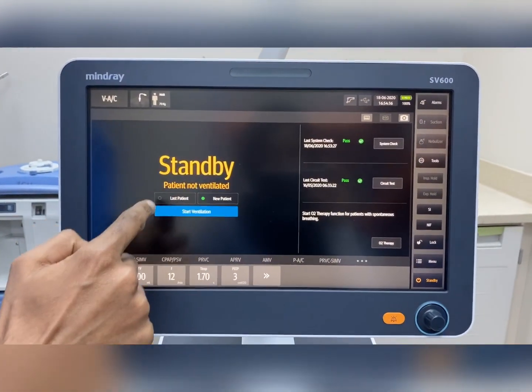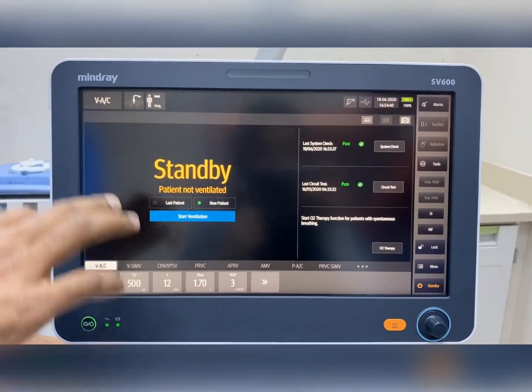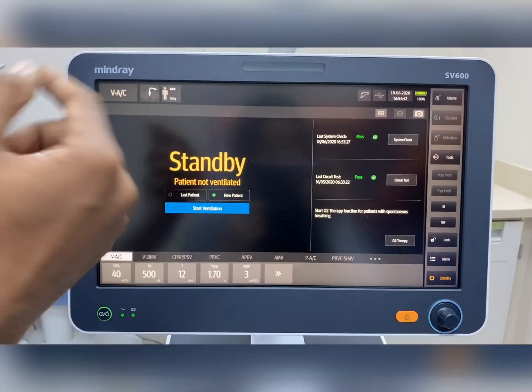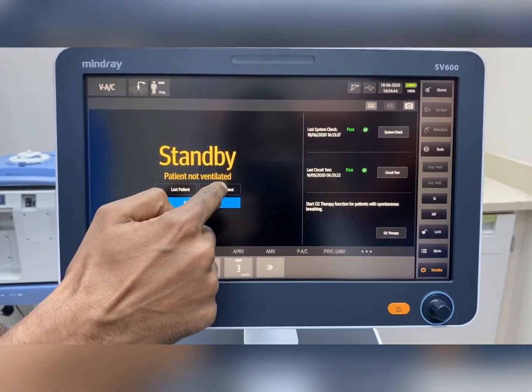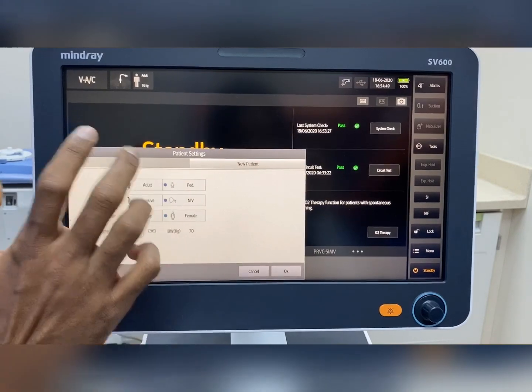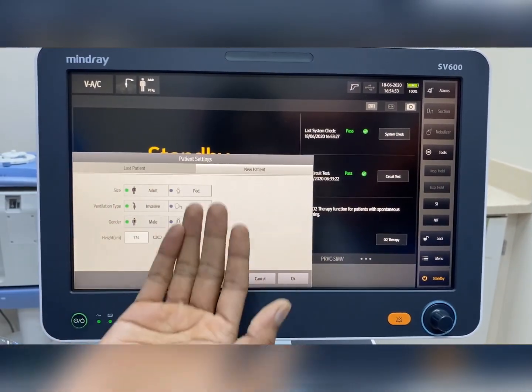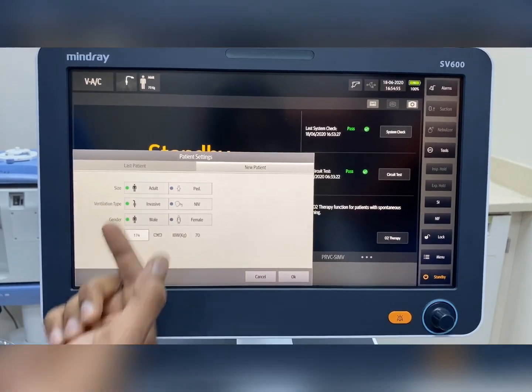The screen is very simple. Here you can see new patient or last patient. For a new patient, there are three options: whether the patient is adult, whether we are using invasive or non-invasive ventilation, and whether the patient is male or female.